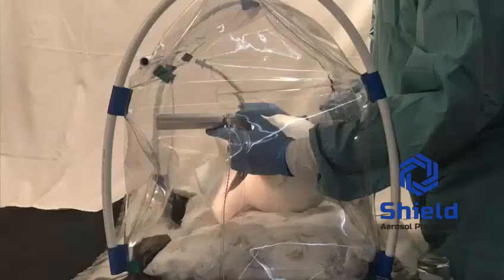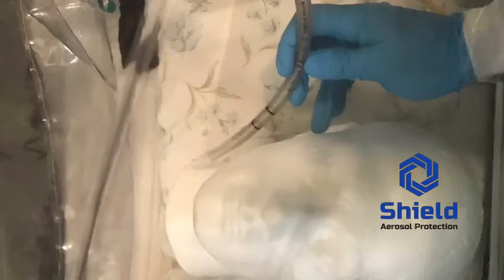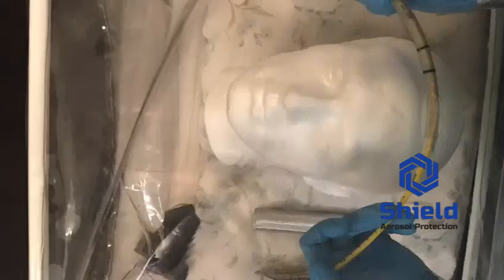At the point of intubation, the anaesthetist realizes that it's going to be a difficult intubation and requests a bougie from the ODP. The ODP passes it through the side flap. The anaesthetist inserts the bougie into the endotracheal tube all the way and lets the curved end of the bougie stick out the front end of the tube. He then uses the bougie that is sticking out in the normal fashion and inserts it into the patient's larynx using a laryngoscope.